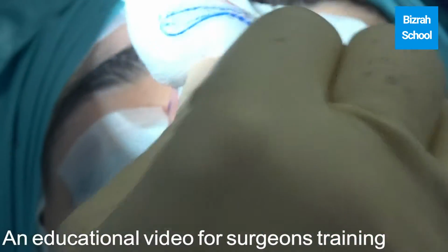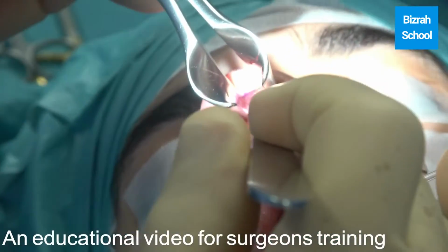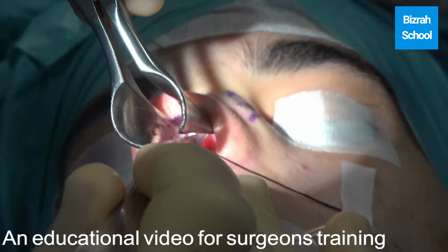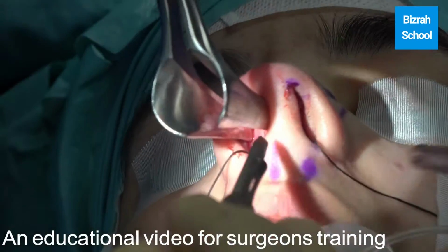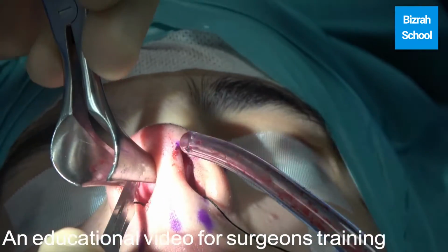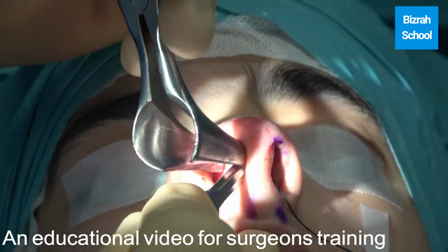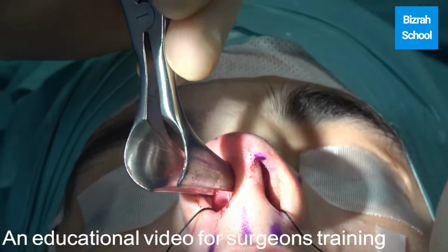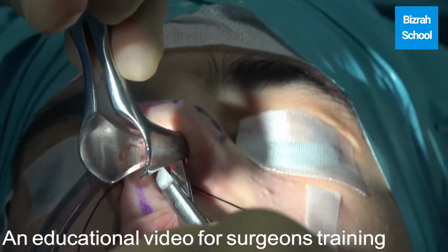Okay. We start now our rhinoplasty. Transcartilaginous incision at the level of the mid-crural cusp and towards the midline. As we said many times before, always try to work in the midline. There is no need to go lateral. So mid-crural cusp and towards the midline, try to preserve the lateral crus, and then do some undermining.